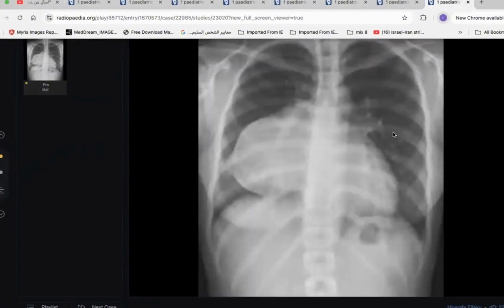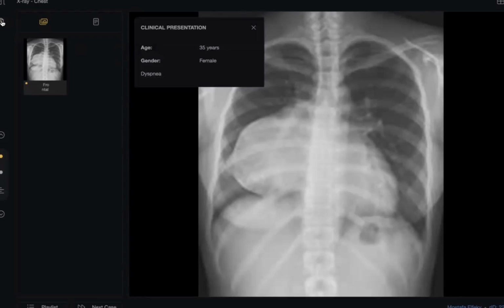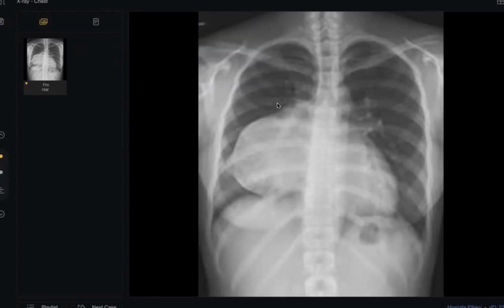Thank you. Any other candidate? Anyone want to take a chance? Yes, I'm available. I need one who didn't take a chance before. Did you take a chance today? No, I've not. Okay, go on. May I have the history or do I just go ahead? 35-year-old female with dyspnea. Go on.